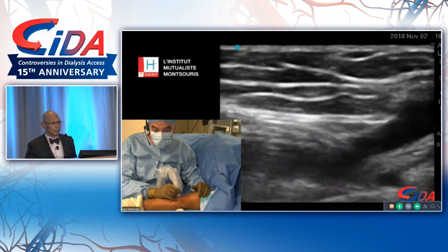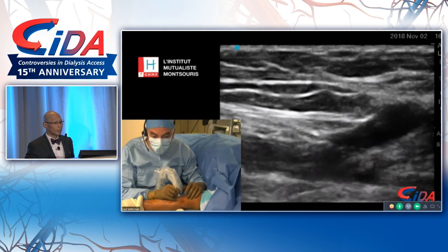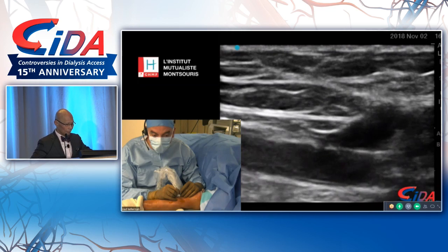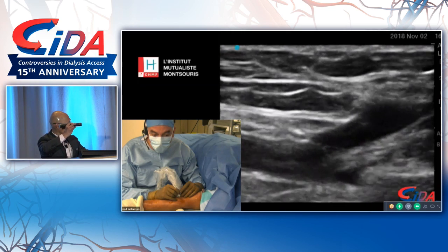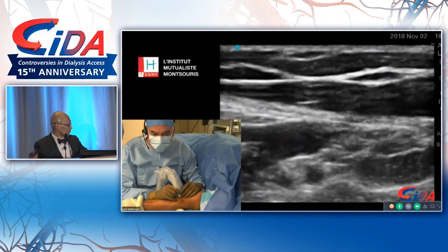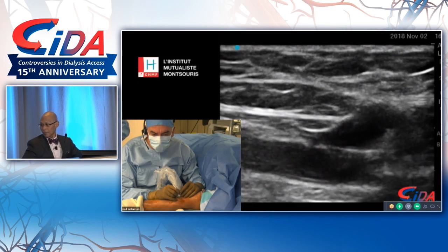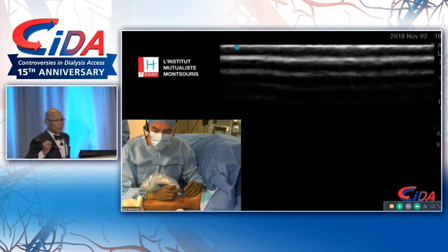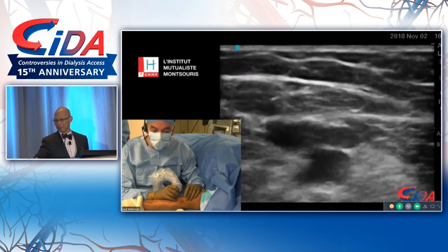Right. Okay, it's the perforator and the last part of the perforator just next to the proximal radial artery. This is the proximal radial. Aris, is it feeding the basilic as well? No, here we don't have a median basilic in this patient.